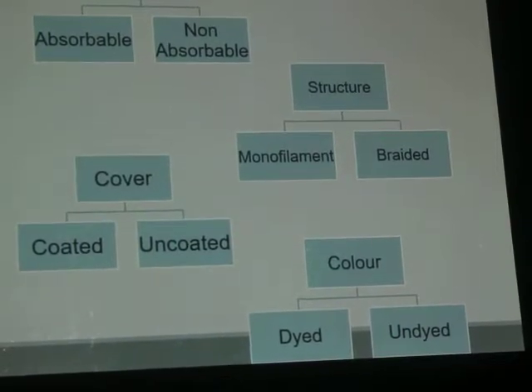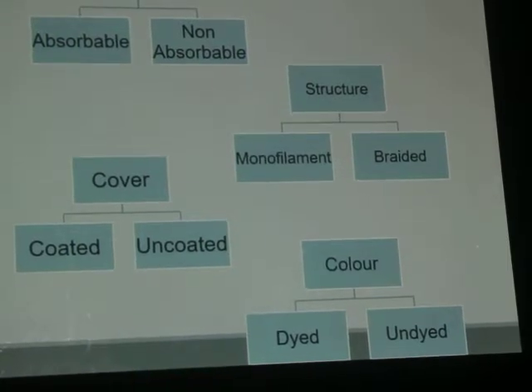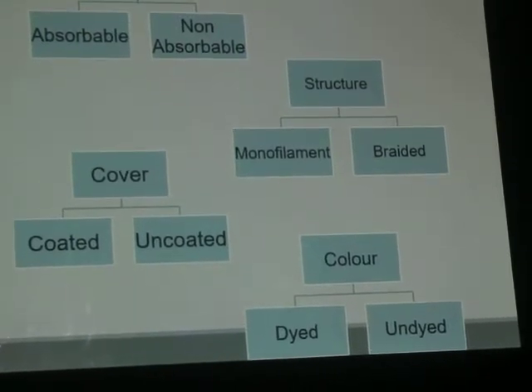فالكالر اوف ذا سوتشر is just for localization of the material. It does not imply anything else.